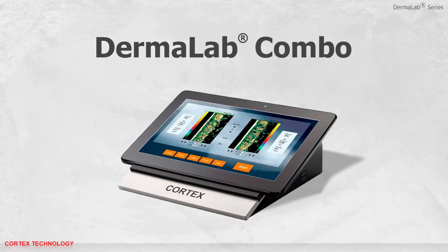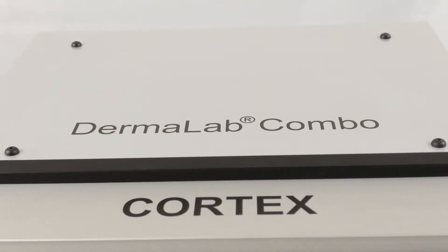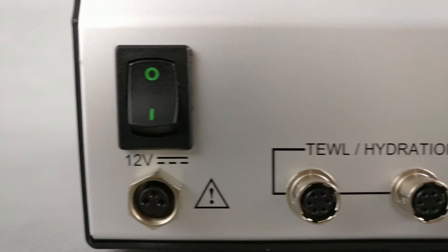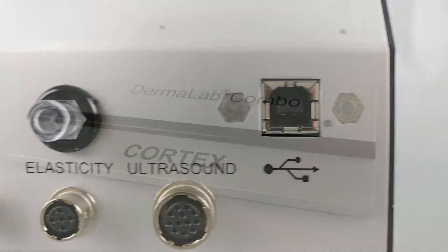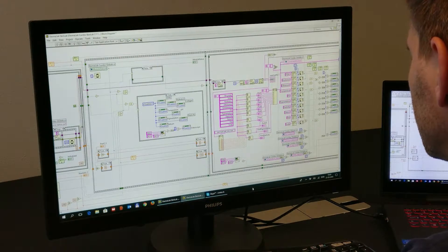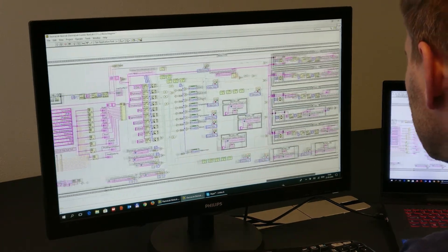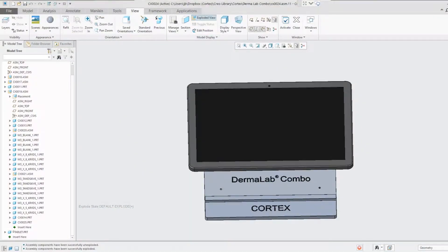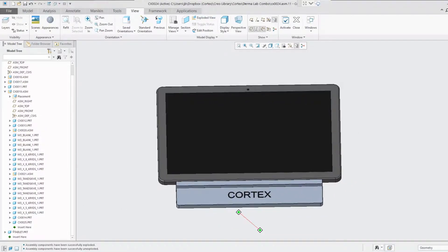Dermalab Combo. Cortex Technology is proud to present the Dermalab Combo, the most advanced skin analysis instrument of its kind, featuring up to 10 different parameters. The Dermalab Combo is the result of 30 years experience of developing and producing skin analysis instruments. The design is based on feedback from leading experts within dermatology, cosmetic and research.